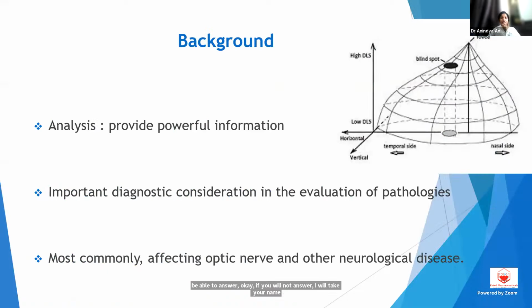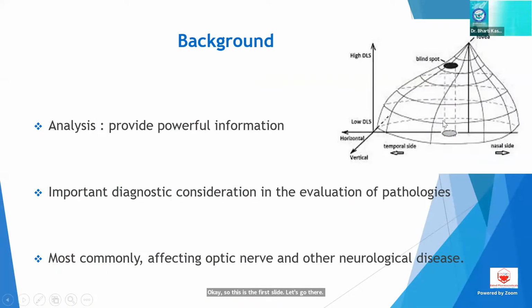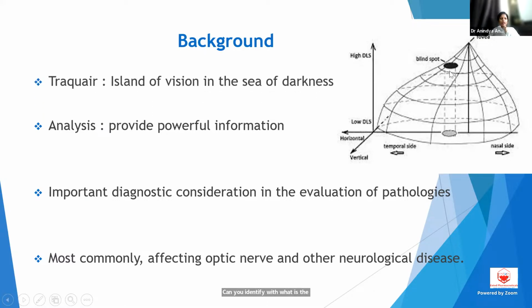Okay, so this is the first slide. You are seeing a picture there, right? What is this picture known as? Dr. Shankar, what is this picture? Dr. Shankar, are you there? Any of the PGs, can you identify what the picture is? No? Okay, so it's actually the visual field.